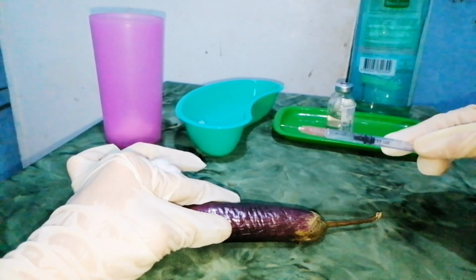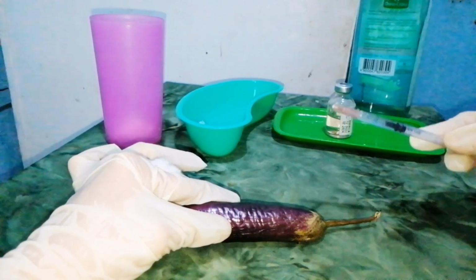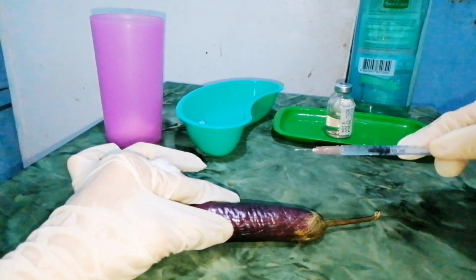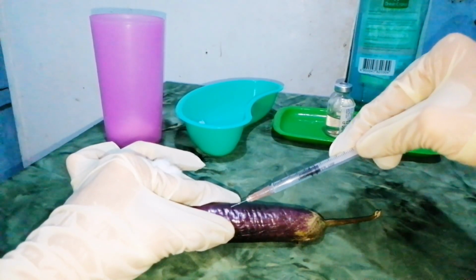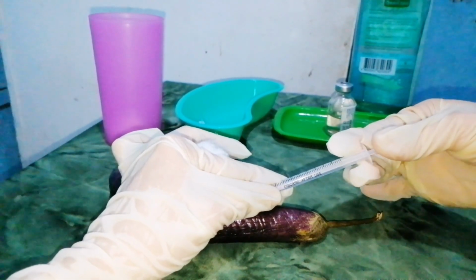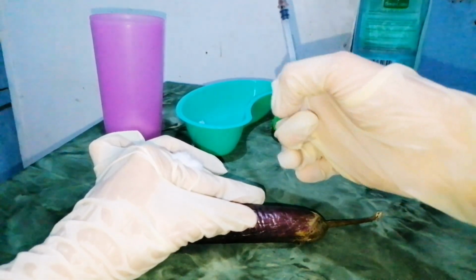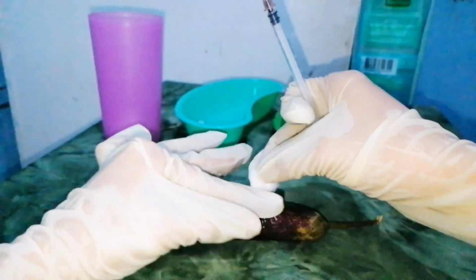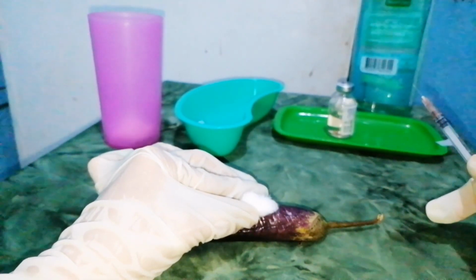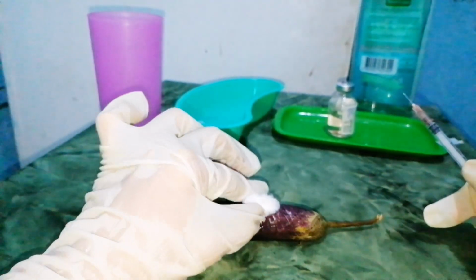When the needle is inserted, move your non-dominant hand to the end of the plunger. Some nurses find it easier to move the non-dominant hand to the barrel of the syringe and the dominant hand to the end of the plunger. Inject the medication by holding the syringe steady and depressing the plunger with a slow, even pressure, then remove the needle. Remove the needle smoothly by pulling along the line of insertion while depressing the skin with your non-dominant hand.